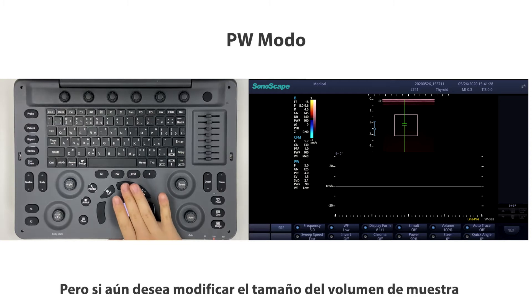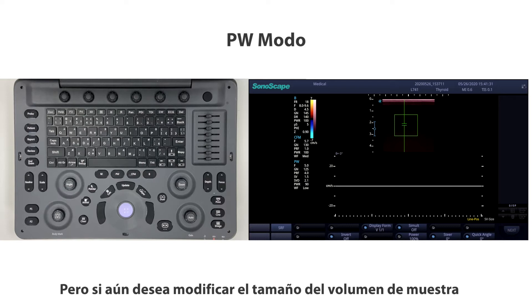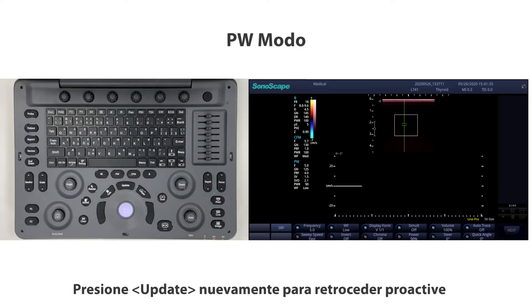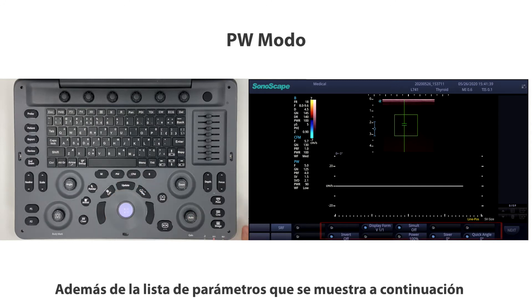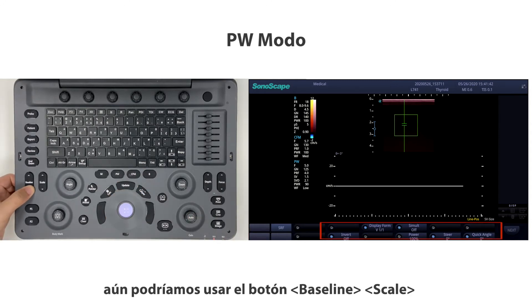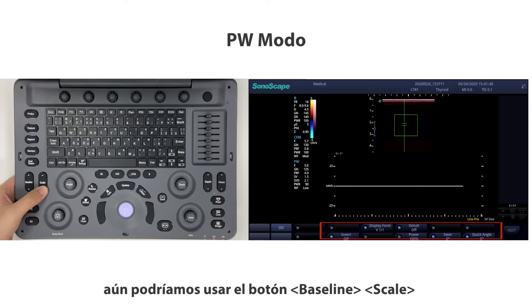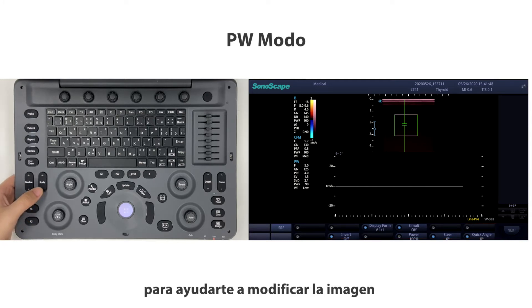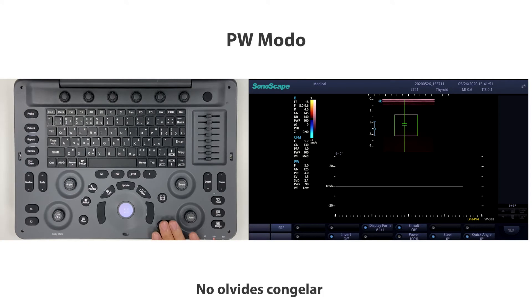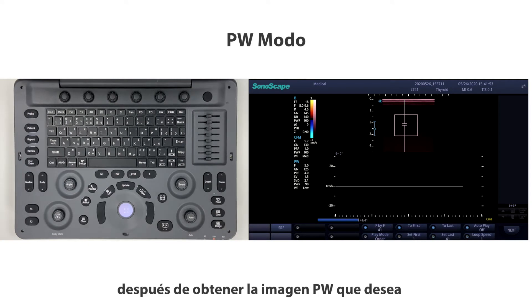If you want to modify the size of the sample volume, press Update again to return to the pre-active state. Besides the parameters list displayed below, you can use the baseline scale button to help modify the image. Don't forget to freeze after you get the PW image you want.